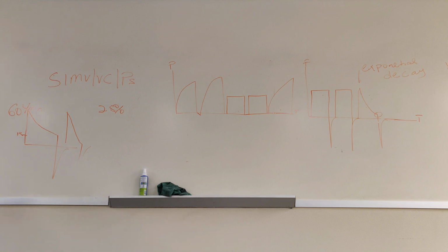Now, let's say that I set my expiratory sensitivity to 50%, and my patient got 60. Well, it's gonna drop down to 50% of the initial flow, which is 60. Here's my 30 here. So what's gonna happen is that the patient's I time is going to be shorter. It's going to be real short because the thing is cycling off earlier. Okay. Well, that means then that tidal volume equals flow times time. That means that the patient's tidal volume is going to decrease because they don't have enough I time to suck out the flow from the ventilator.